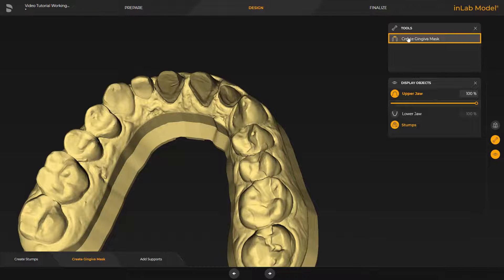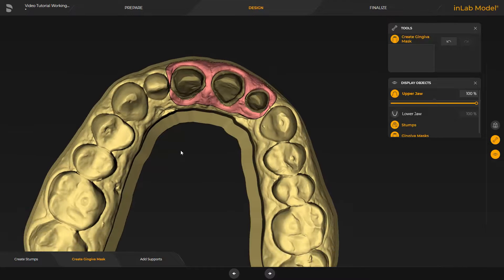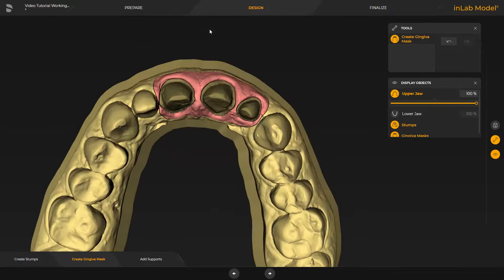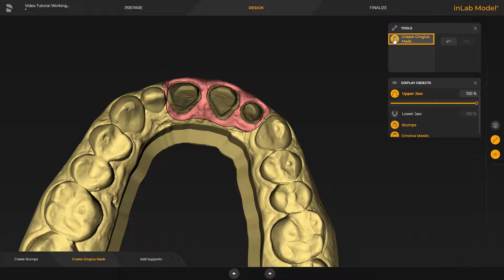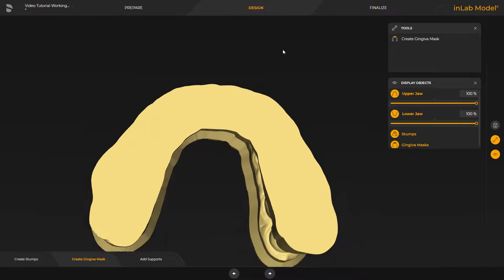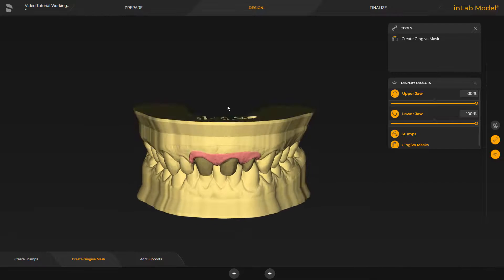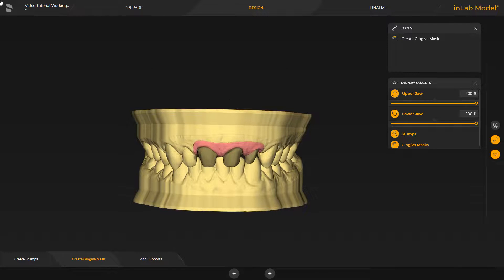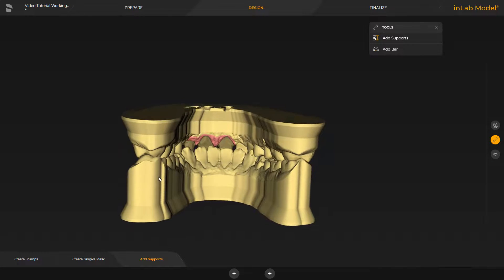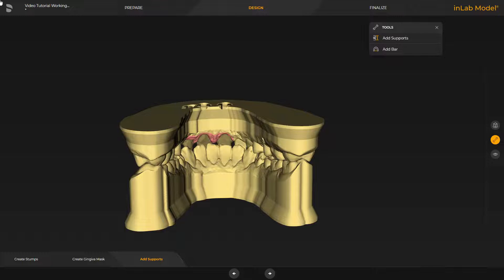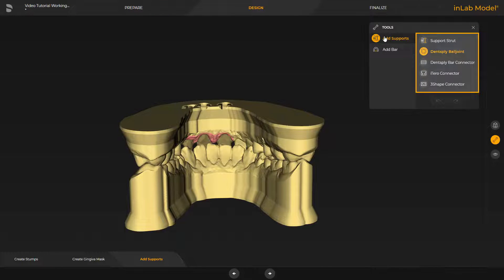We select the corresponding tool and define the preparation line of the Gingiva Mask. Since the procedure is the same as with the Clean Model step, at this point we will skip the modification and next you will see the final calculated Gingiva Mask. We disable the tool again, enable the lower jaw, and switch to the last step, Add Supports.